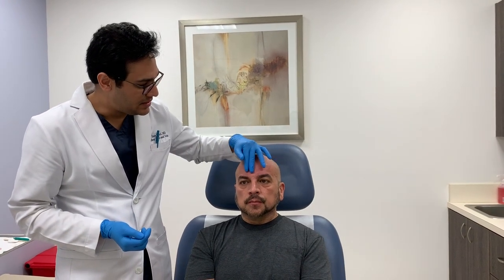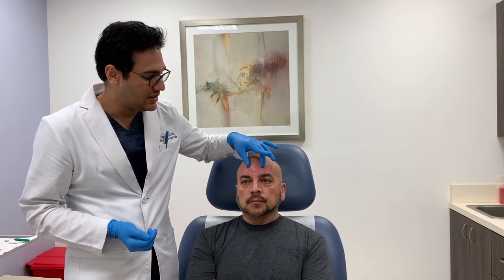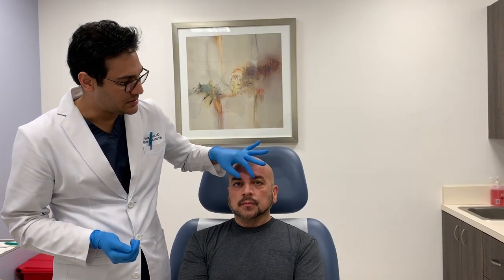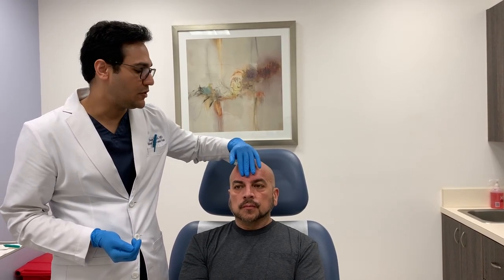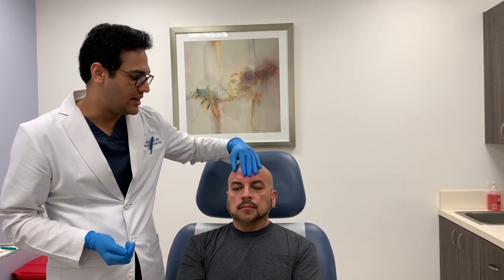All right guys, so that's it. Today what we did was I injected Restylane Defyne into the central forehead using a needle, and then I also injected Dysport into both of these corrugators and the procerus muscle. Over the next two weeks, these muscles are going to relax and the filler is going to continue to spread into this supraorbital hollow right here and address the volume loss he had in the forehead.